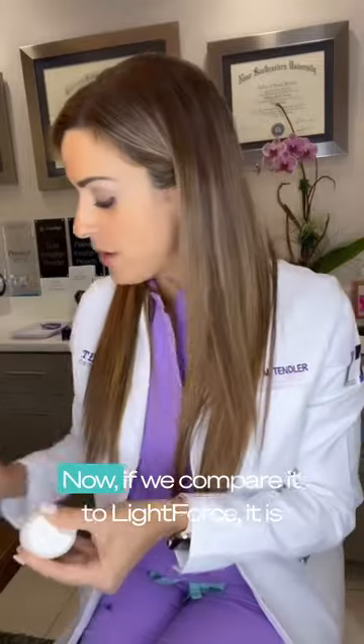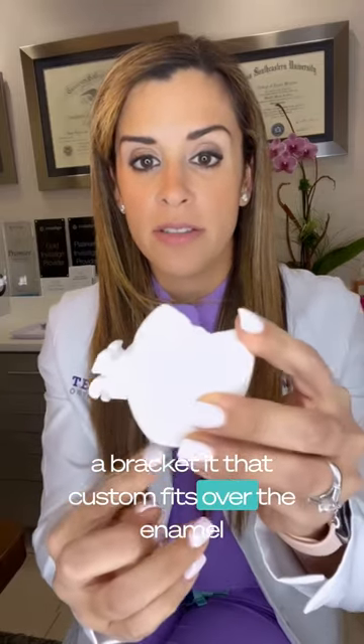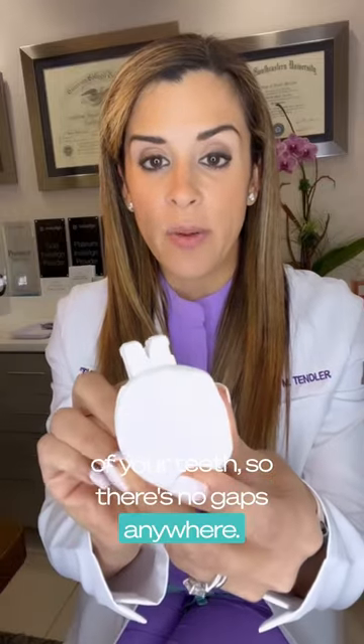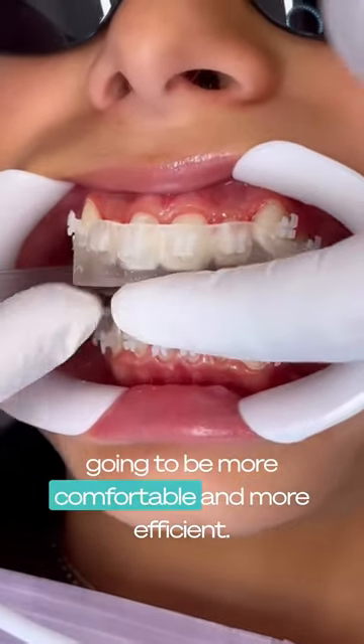If we compare it to LightForce, it is a bracket that custom fits over the enamel of your teeth, so there's no gaps anywhere, and it's going to have more accurate control of every tooth as we move it. So it goes without saying that it is going to be more comfortable and more efficient.